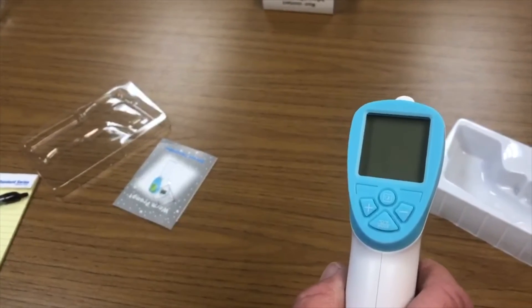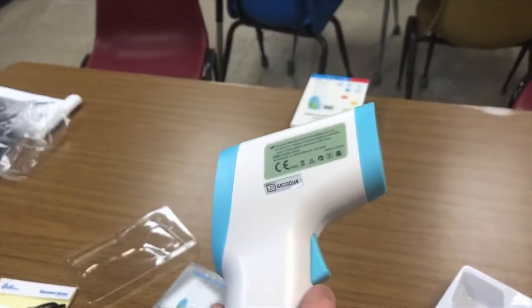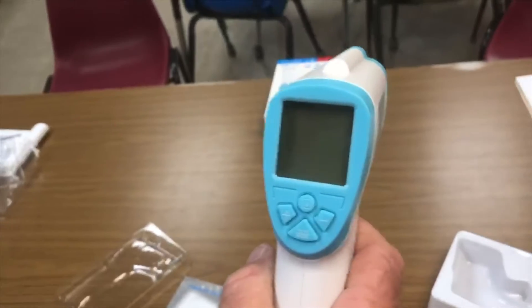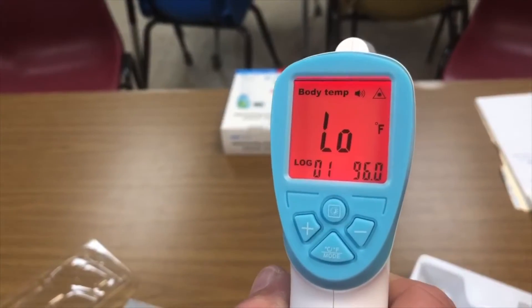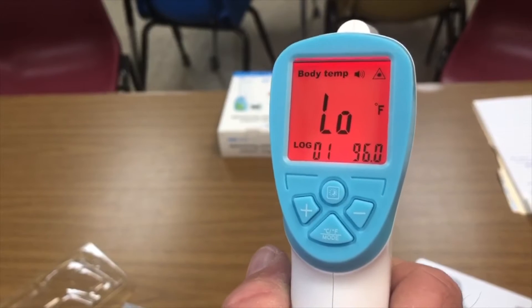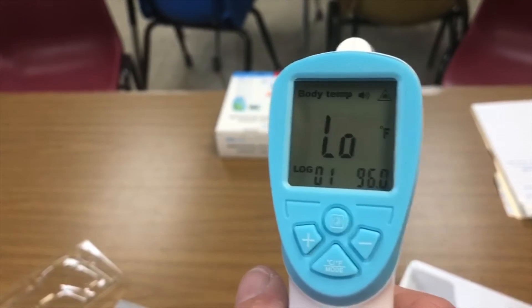This thermometer is the Bra thermometer. There's a trigger on the front that turns it on — pull the trigger one time, click it, it lights up, and it's ready for temperature. You take these temperatures within two inches of the forehead.